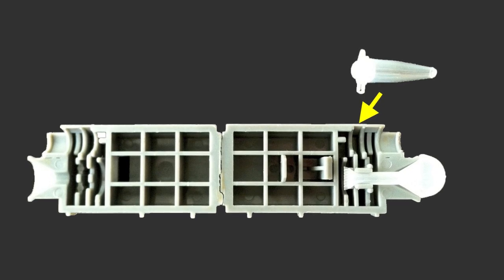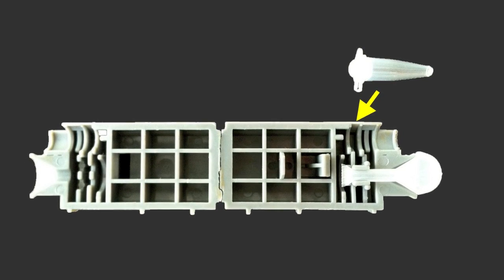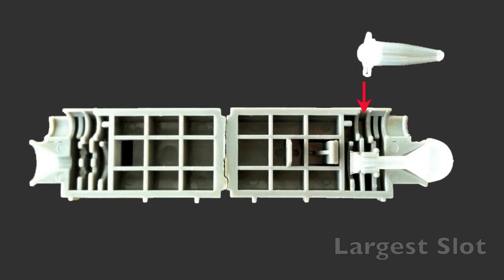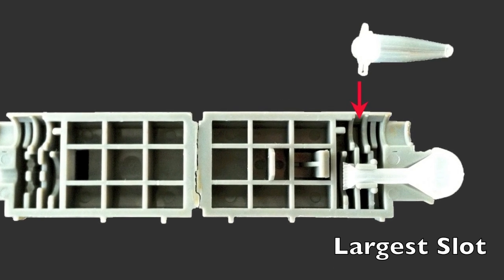Place the reaction tube into the amplicon cartridge. Be sure to place the hinge of the tube cap into the largest slot adjacent to the buffer bulb.